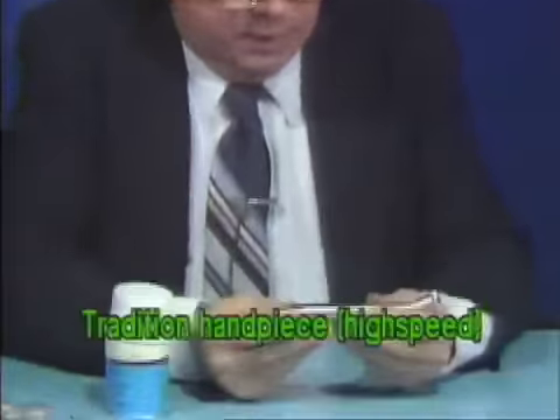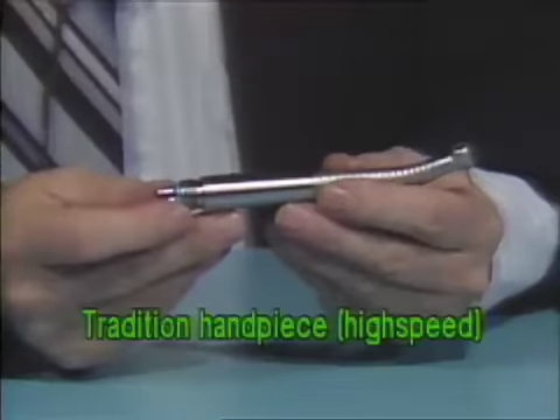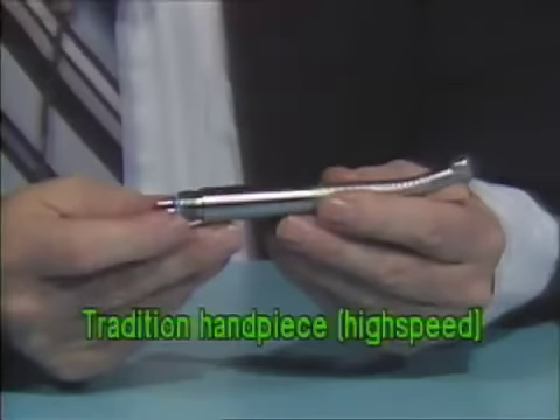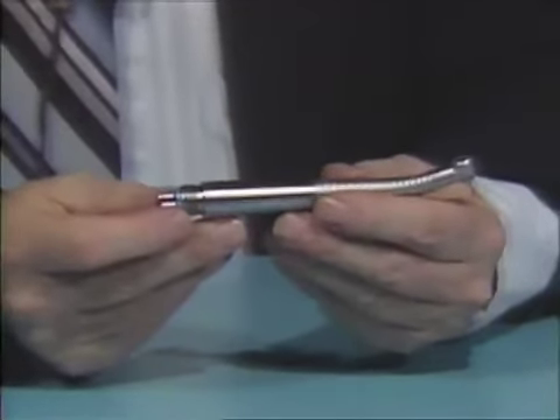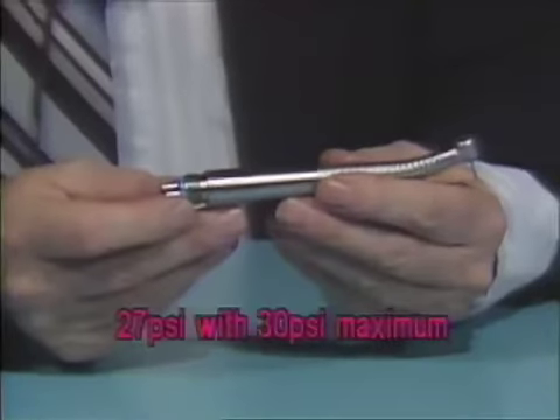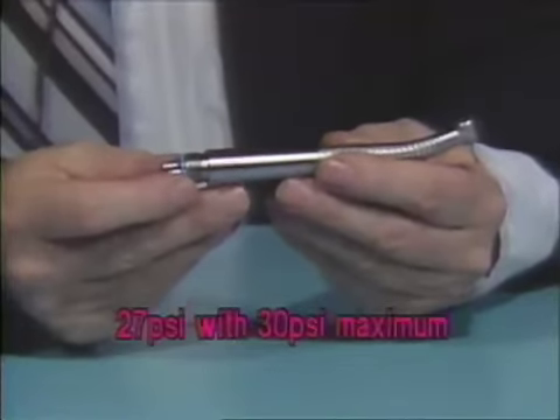This segment covers the care and maintenance of the traditional handpiece. It is a high-speed handpiece. The air pressure it operates efficiently at is 27 PSI, with a maximum of 30 PSI.